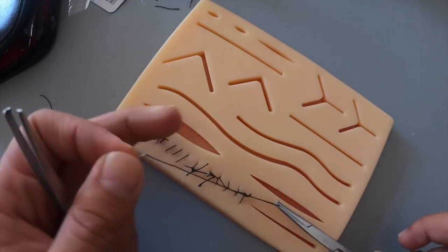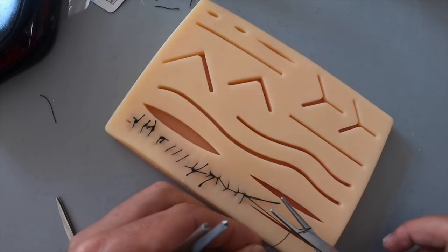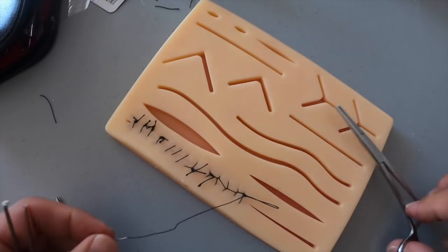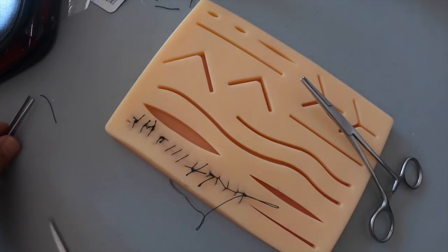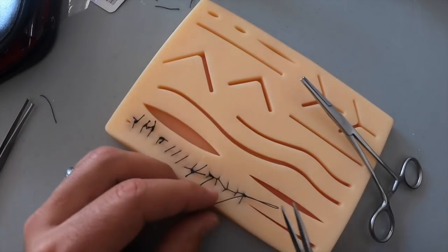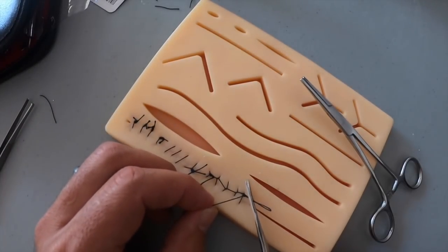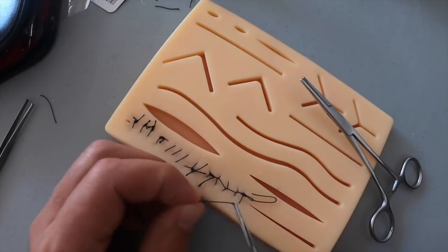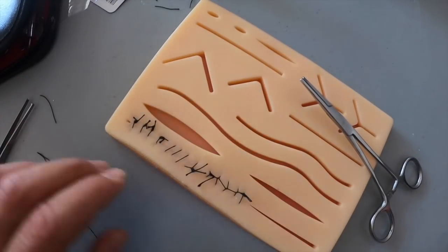We have about five or six now. You don't have to do it so many times because it's silk, you're going to take the loop and it holds the stitch very well. But if it was prolene or ethilon, I'd probably do like eight of them just to make sure it holds.